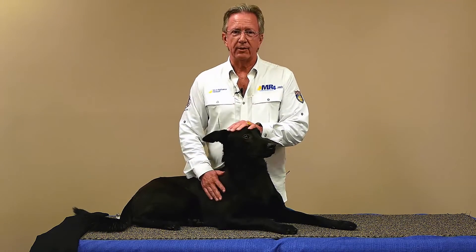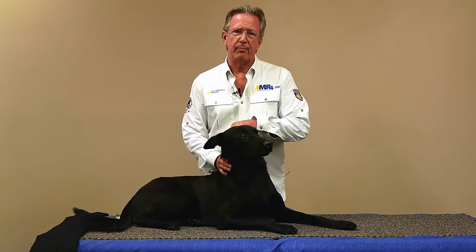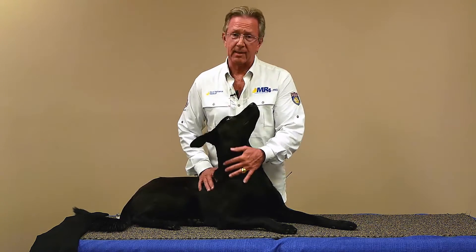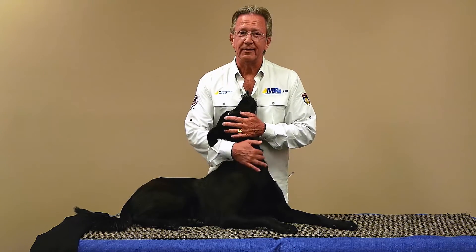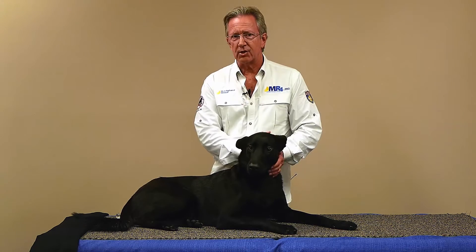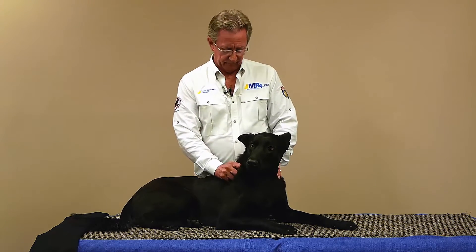We're going to talk first about the unwind protocol. This is really the most basic and a really good protocol to use on all animals, especially if they haven't had a laser before, to help them get acclimated to it. It's a wonderful one to use for general conditioning and especially for pain relief.